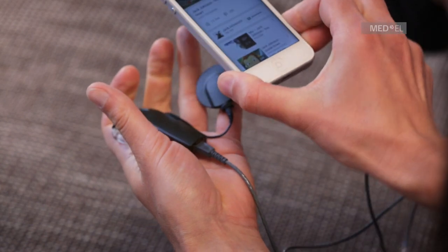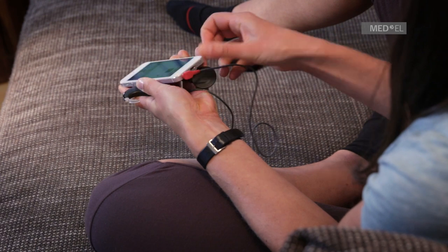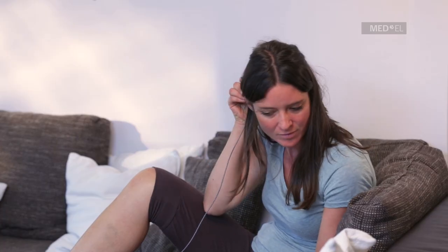The EXT cable has a red plug and provides signal only from the external audio source. The MIX cable has a yellow plug and will provide a mix between the external audio source and the microphones.